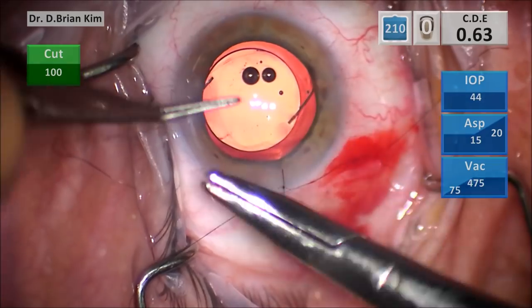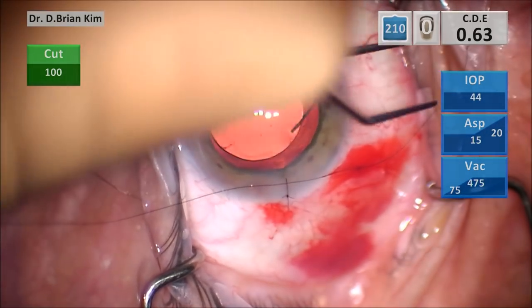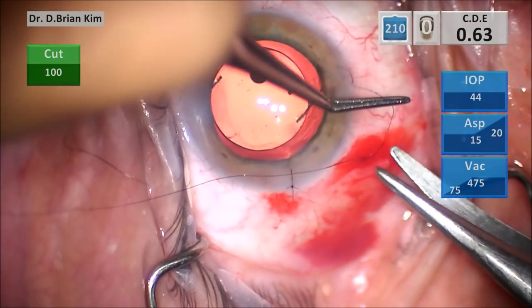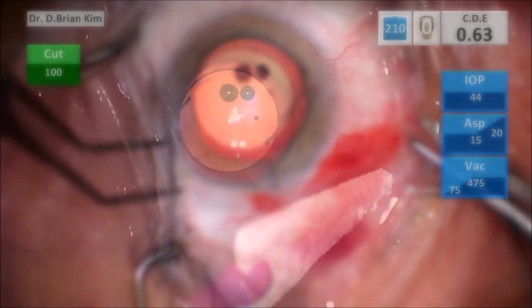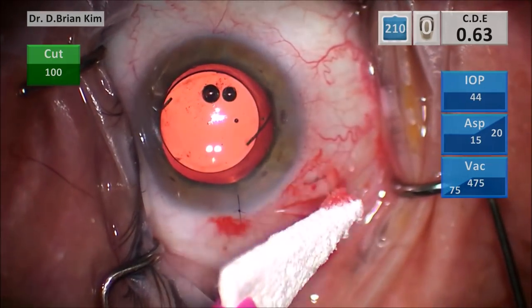Keep the chamber stable, put some dispersive viscoelastic in the eye, and then very carefully, under low flow settings, you can remove cortical material. You can do a dry aspiration technique using a BSS cannula.